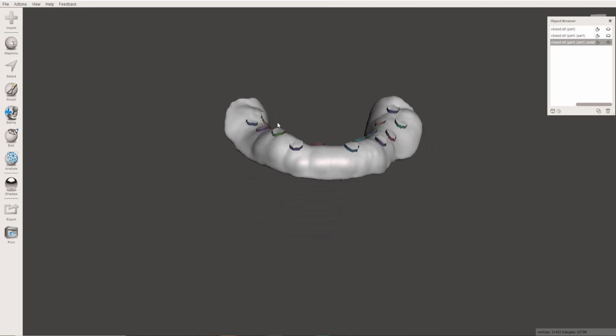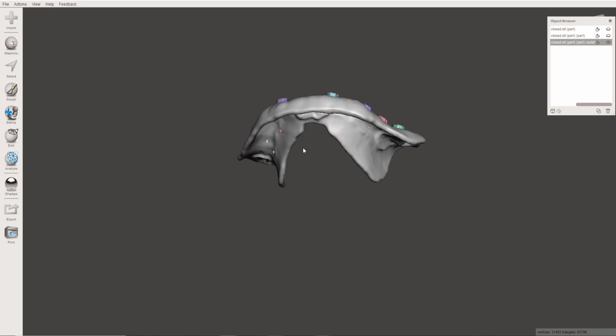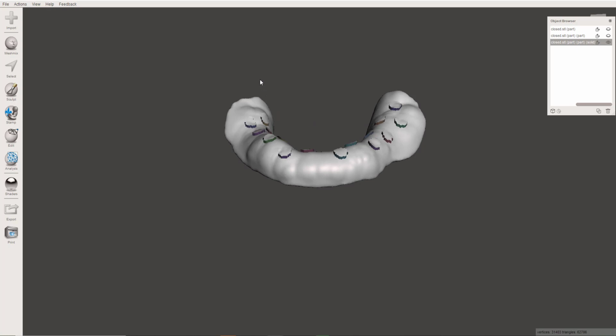So that would mean starting with the maxillary, dial it in, get it parallel with the interpupillary line, with the ala-tragus line, mark your midline, mark your canines or the commissures, and then trim the wax and close the vertical until you have the right VDO using your lower. So the end result would be that you have an upper and a lower tray, and that has a master impression inside of it, but you've simultaneously gotten your records appointment done.